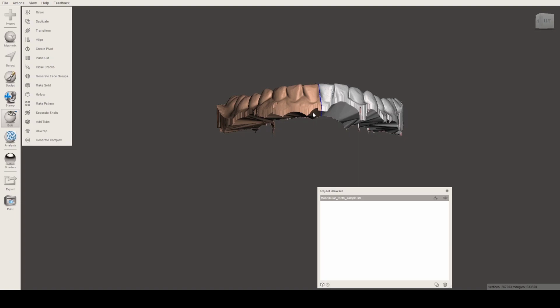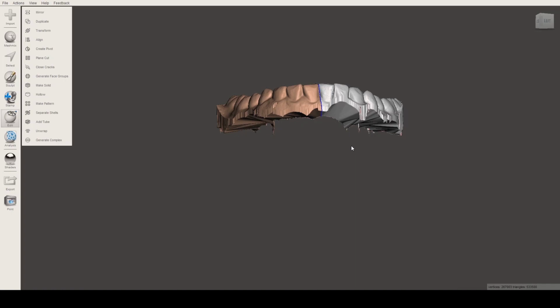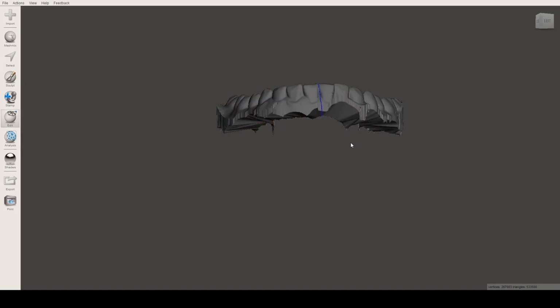file earlier. So we're just gonna Control Z our way back to the combined version, the not separated version of our object. And there's a line as well. Oh, this is not it. So I'll just Control Z.